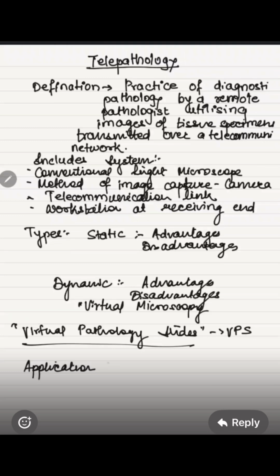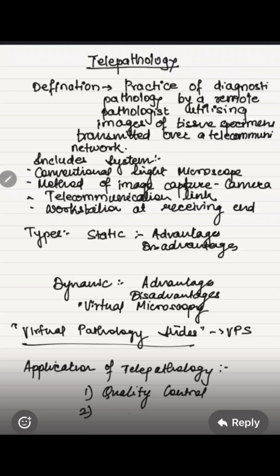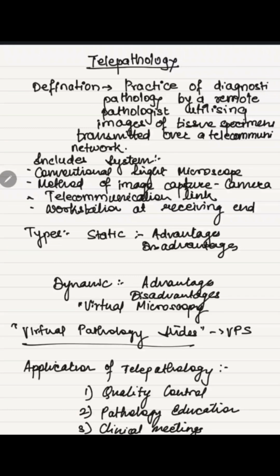Okay, the next term is virtual pathology slide. This is a newer term, virtual pathology slide. This is called VPS. Okay, as the era of digital pathology in the 21st century has reached its zenith with the availability of technology for the preparation of virtual pathology slides by high speed scanners and then storing the scan data in large memory output computers. So VPS stored in the memory of the computer can then be examined and reported.